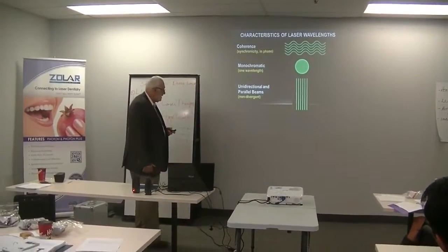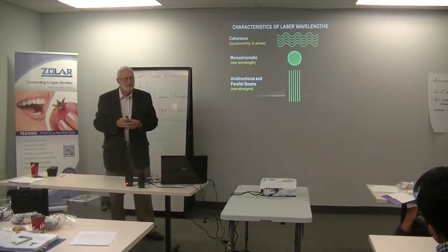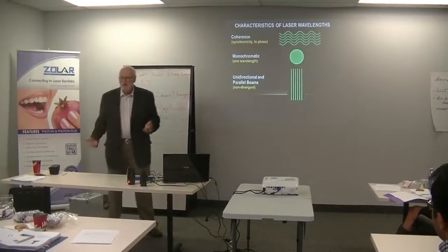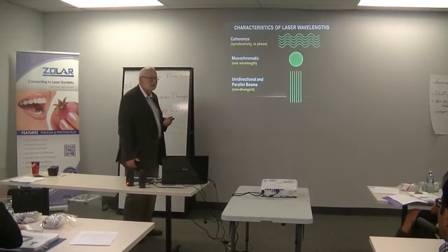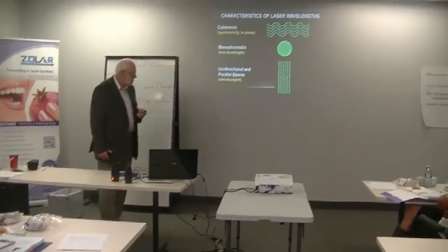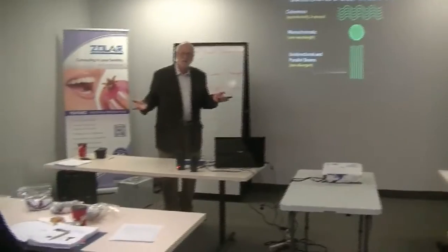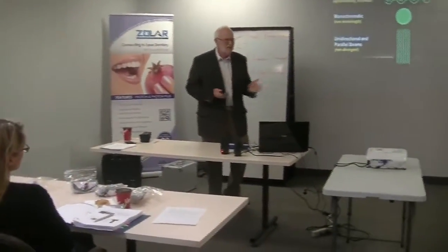They're also monochromatic. What does monochromatic mean? Light has different wavelengths. For example, this is green. That's in the 500 range. We use curing lights. They're in the 400 range. They're blue. We've got red lights. We've got infrared lights. So the laser you've got is actually infrared, so you can't see it, so it's got an aiming beam. When I say the wavelength, for example, this is 810. When we get to low level, you might be talking 660 nanometers. So each wavelength has different characteristics.